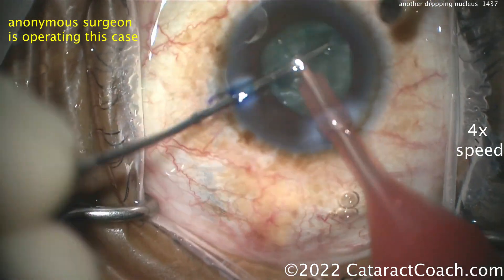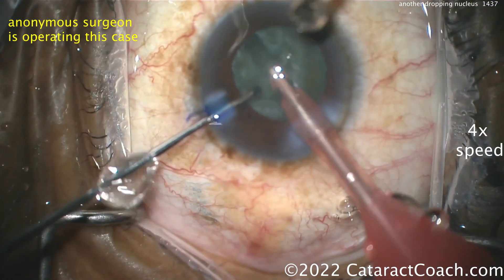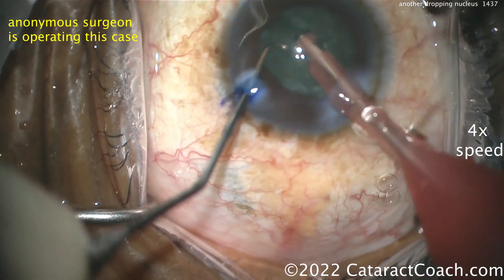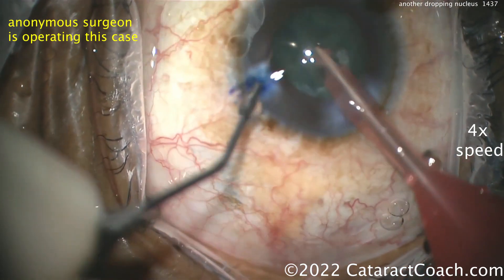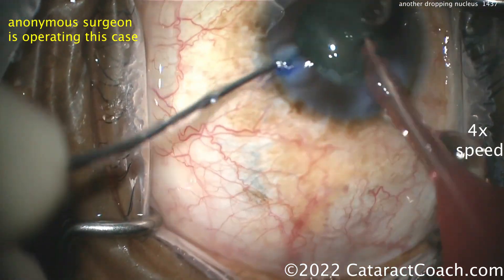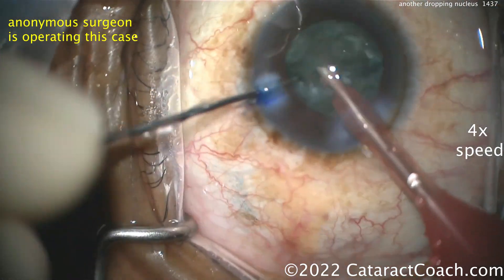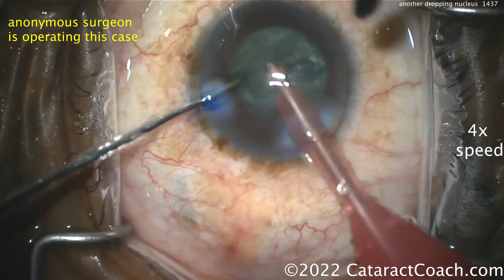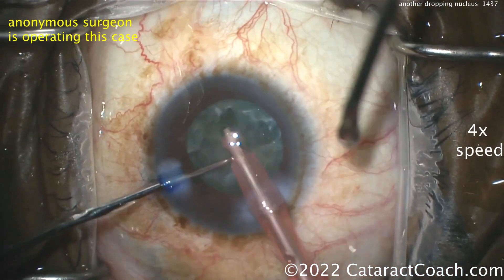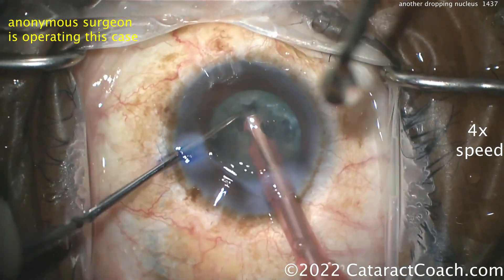Splitting the nucleus — let's see what happens. Here's a very important pearl: if you ever meet another cataract surgeon, ask them, 'Have you ever dropped a nucleus?' There are two types of doctors who never have complications — those who don't operate, and those who aren't quite fully truthful. If you've met a cataract surgeon who's done at least a few thousand surgeries, there's a hundred percent chance they've had a dropped nucleus.